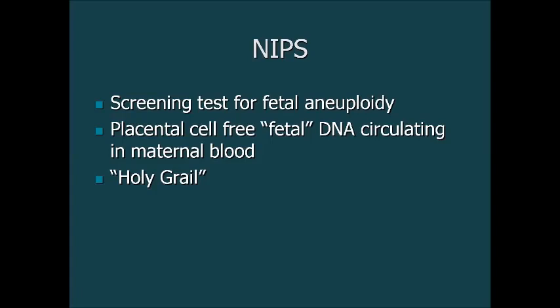Some people have described this as being a holy grail of sorts, in that the access of fetal DNA non-invasively through a maternal blood draw has the potential to allow for the evaluation of any portion of the fetal genome at will.